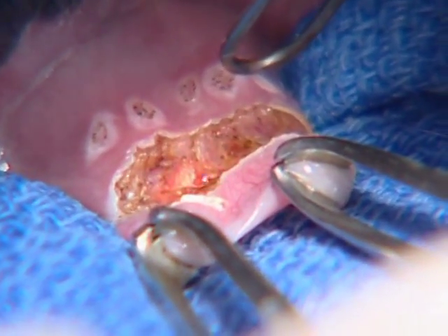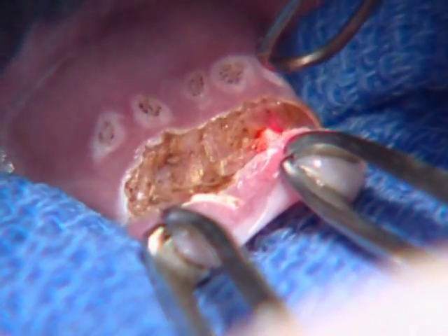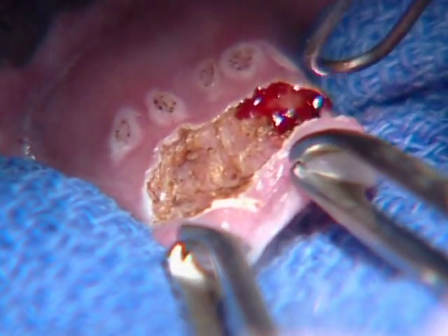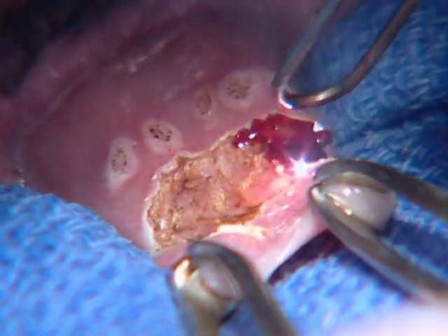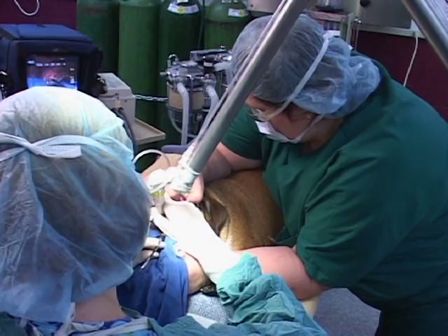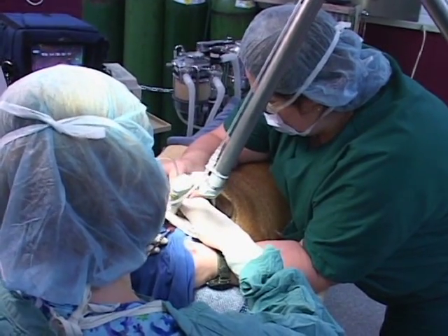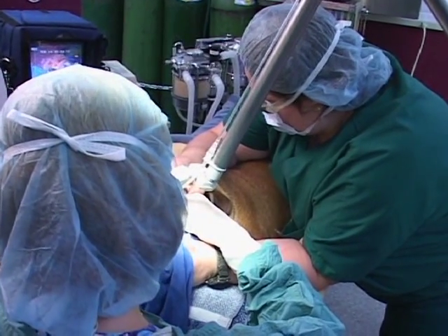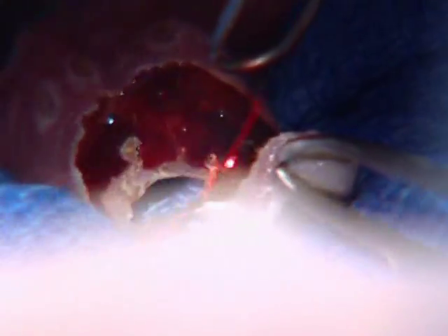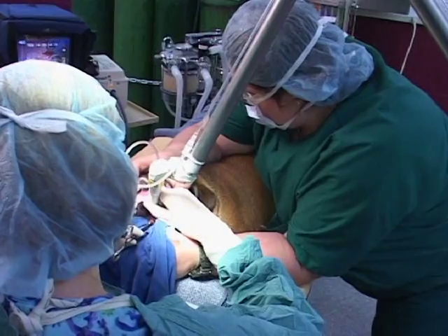Right now just taking my laser slowly across the palate, below my dots. There's a tight area — please move slowly. There's that lateral vessel. We're going to keep going across it though. The laser will provide some hemostasis.